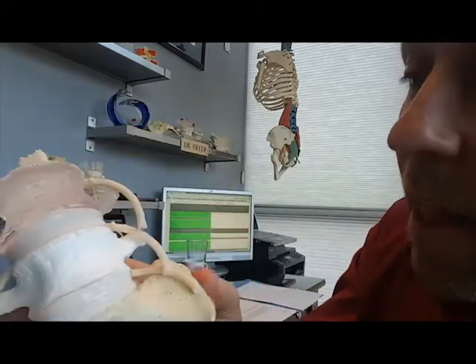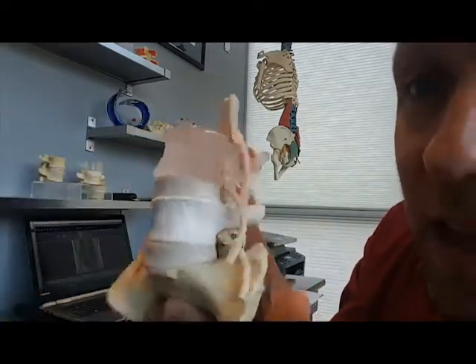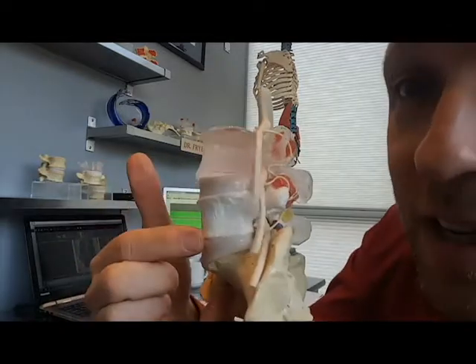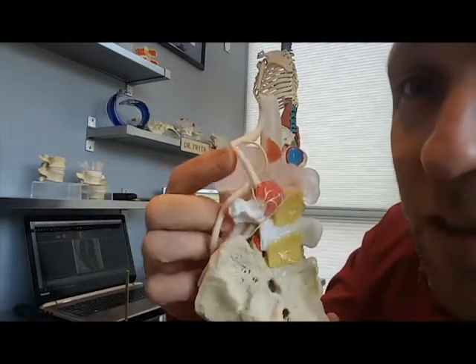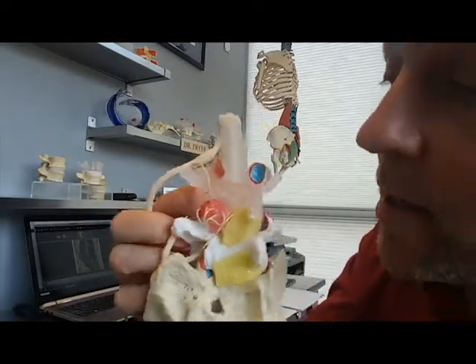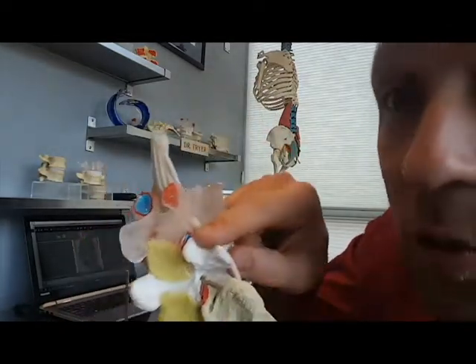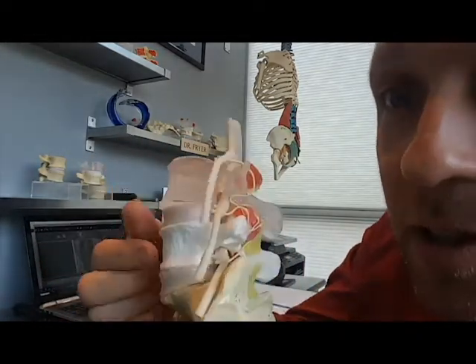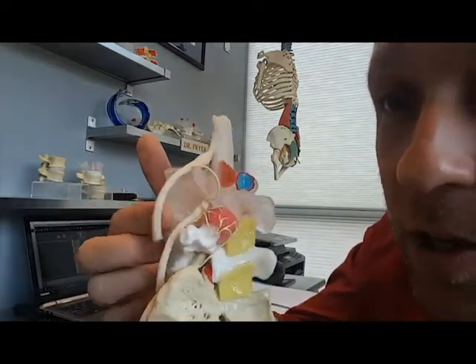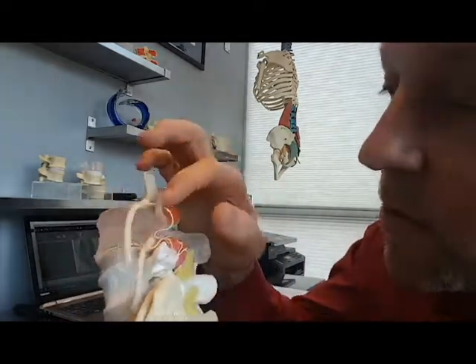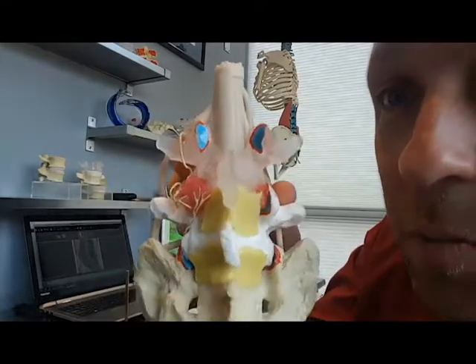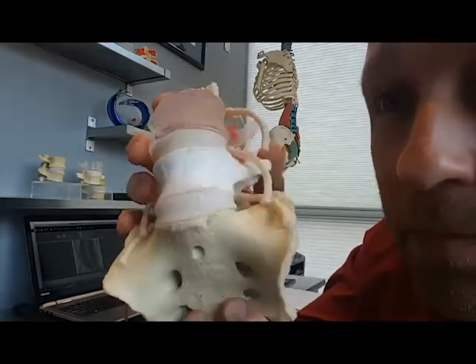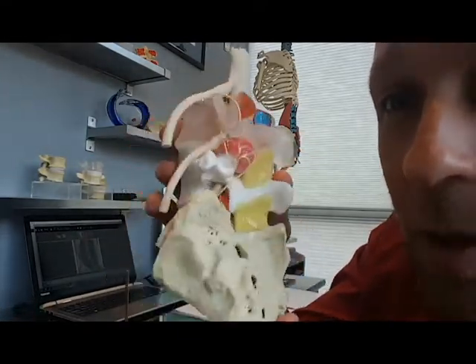So that was just a little example of the disc as it relates to the facet joint, the joint space width, and strategies to increase the joint space width, and also the medial branches shown on this medial branch model. I hope that was helpful. Thank you.